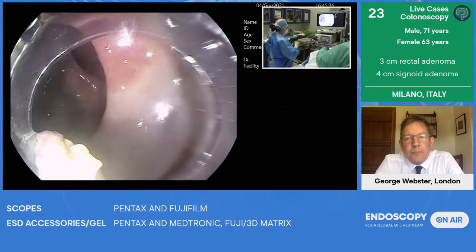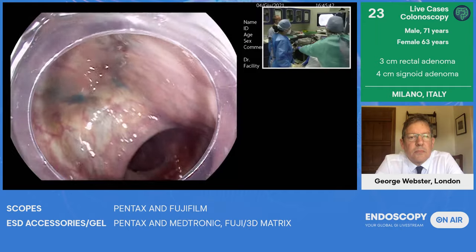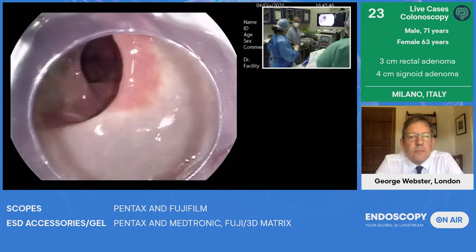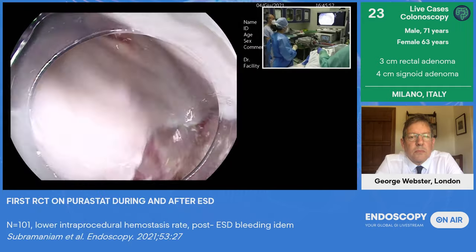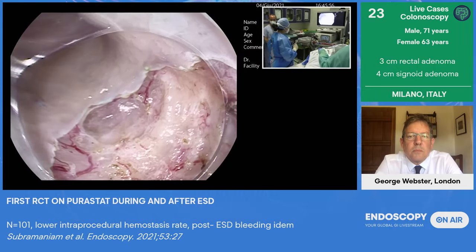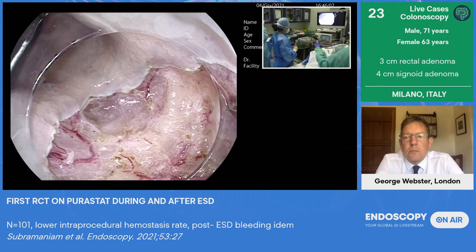I want to remove it because it's tiny, and otherwise I need to collapse all the colon or the lumen, because to apply Purastat we need to use gravity, and we are opposite to the gravity. So in this case, the Purastat will go on the other side. I want the lumen to be collapsed, otherwise the gel won't stay in the target place that I want. So in 2021, again, we should remove this type of lesion en bloc.